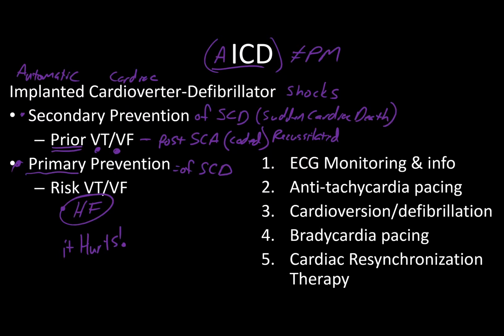And it was his defibrillator. Of course, we were waiting for the cardiologist, who was on their way, and we were making adjustments to try and prevent that from happening. But they could feel it coming. They could feel it when it hit. It is not a fun thing to happen. And so the most important advice I can give you for patients who have an AICD that is going to be firing, and that there's a chance of it, do not hold their hand, because you'll get shocked too.